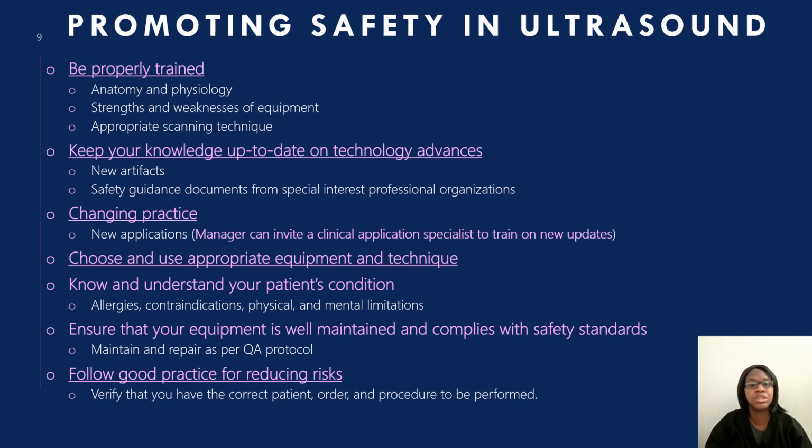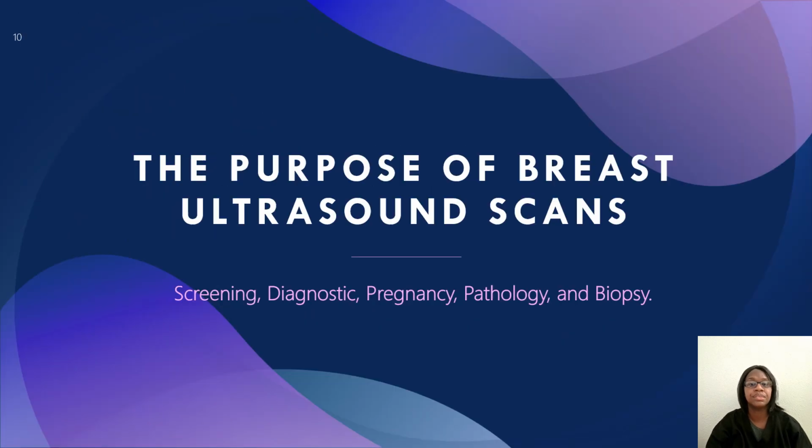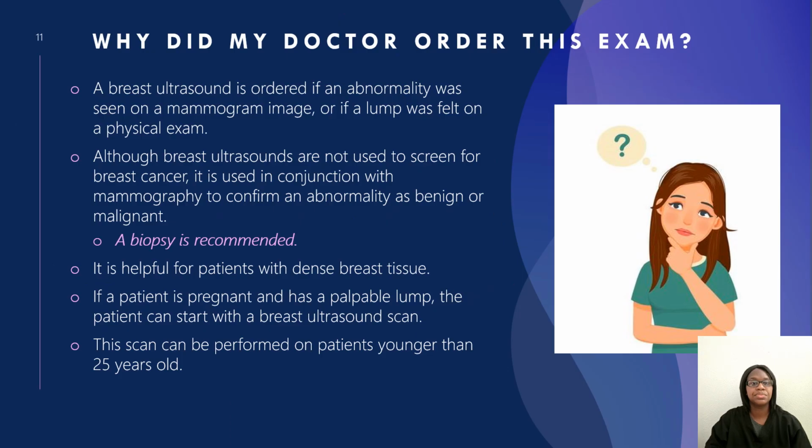And then you want to make sure that your equipment has passed QA and QC. And make sure that you are following all the good practice to reduce injuries, whether it's verifying that you have the correct patient, the correct order, and the correct procedure is being done. So now I'm going to get into the purpose of breast ultrasound scans. This is going to talk about screening, diagnostic, pregnancy, pathology, and biopsies if needed.